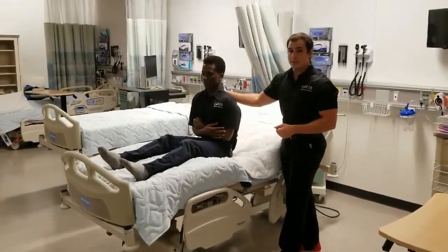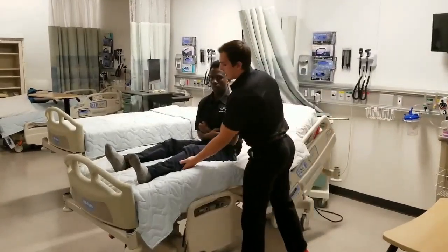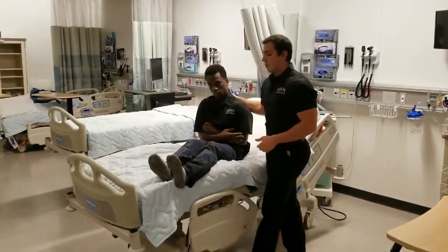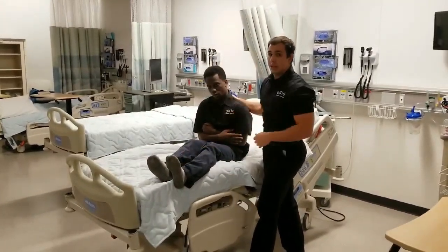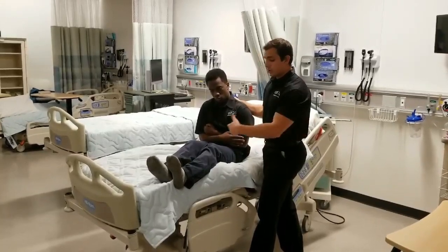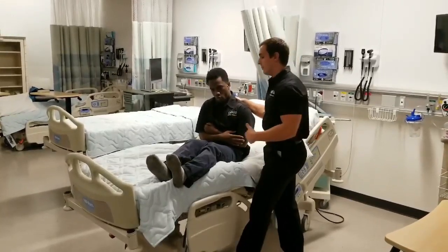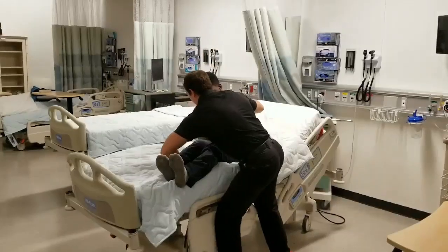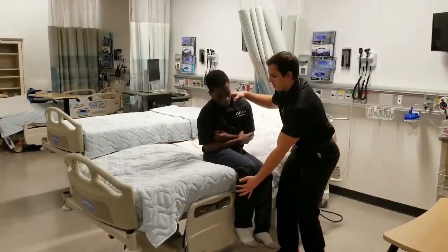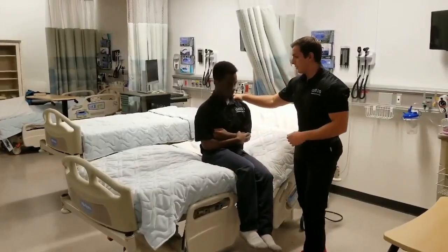They're in the long sitting position here, so what you'll do is abduct and adduct the legs to the edge of the bed. And then you'll grab across the legs again, behind the knees, just below the level of the patella, and you'll pivot the patient to sitting at the edge of the bed. In 3, 2, 1. Are you comfortable in this position? Perfect.